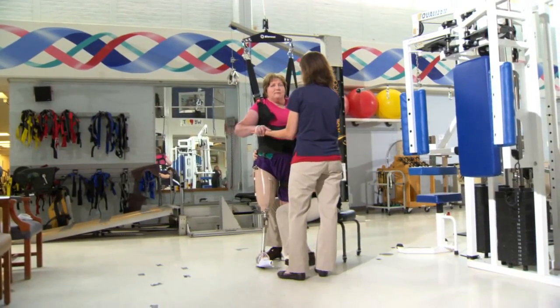One of my most memorable patients was working with an amputee. She didn't walk very far because she started complaining of back pain typically when she was walking. And when we watched her walk, she tended to come forward over her knee. So we got her in the Vector.